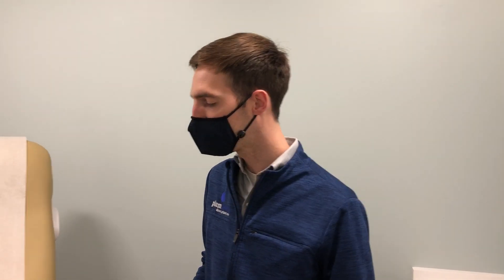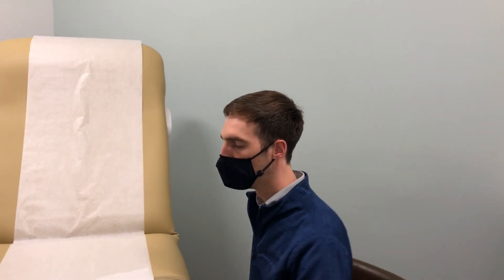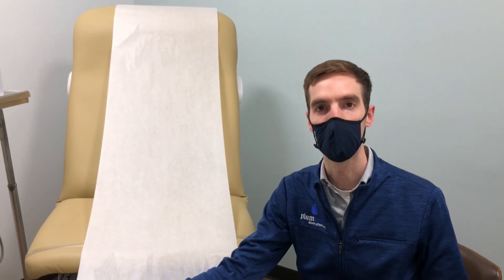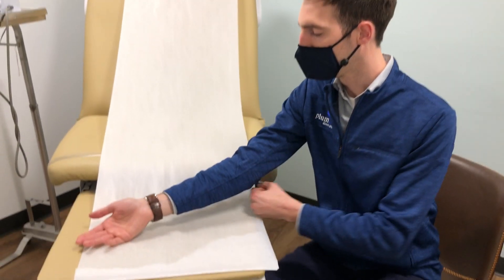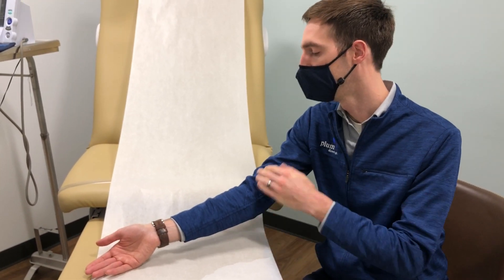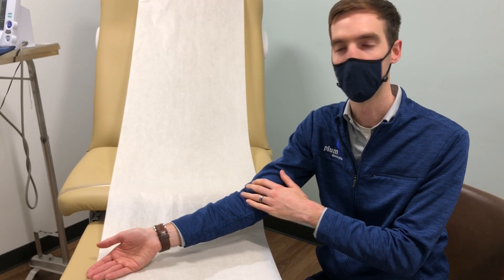I'm going to show you quickly how we draw blood in our office. Basically what we do is have the patient seated adjacent to the exam table. We'll pull out this footrest and pull down the paper like so, and then have the patient rest their wrists and put their fists underneath their elbow just to straighten out and show all the veins in the antecubital fossa area.